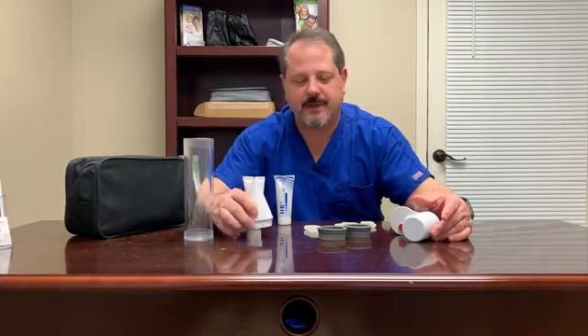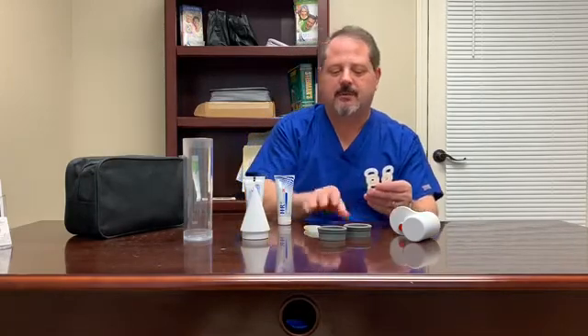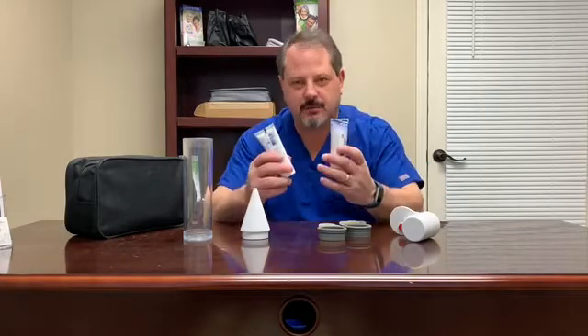It comes with the cylinder, carry case, loading cone to load your bands onto your cylinder, three different size ultimate round mock rings that you can use to experiment with to find the appropriate size you need, and two tubes of water-soluble lubricant.